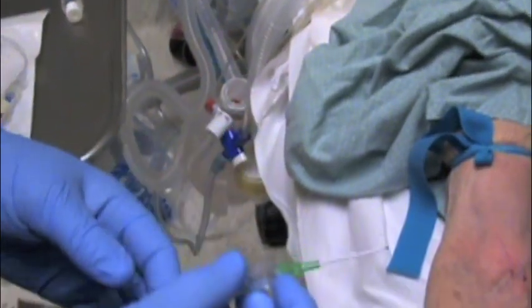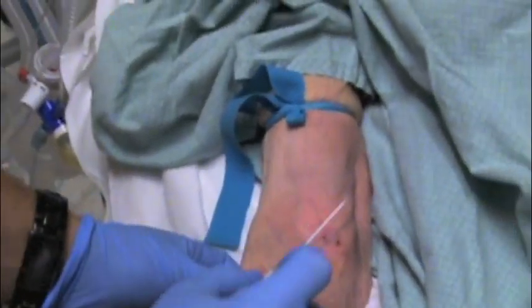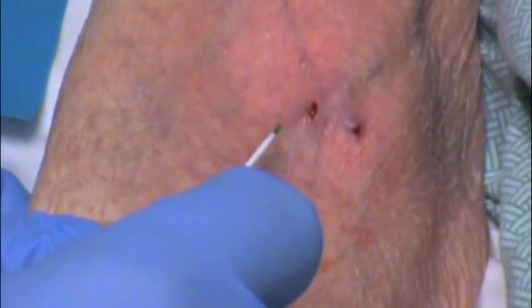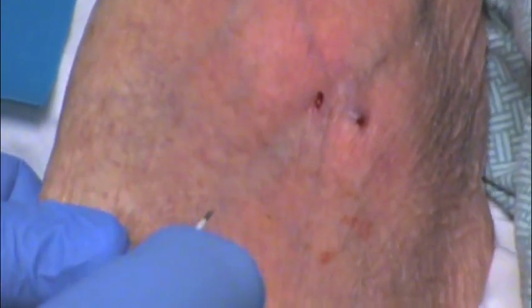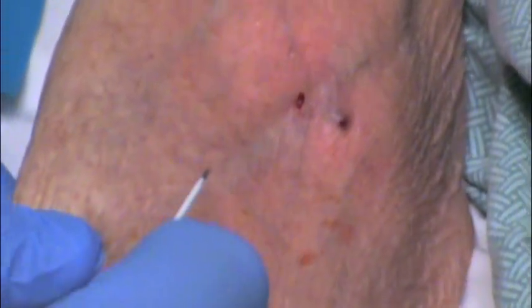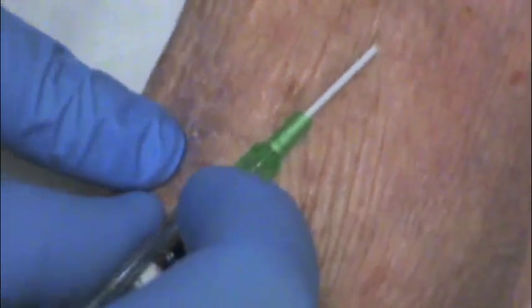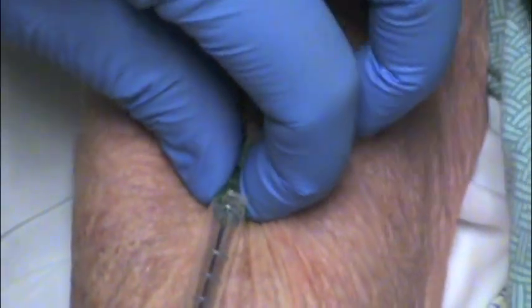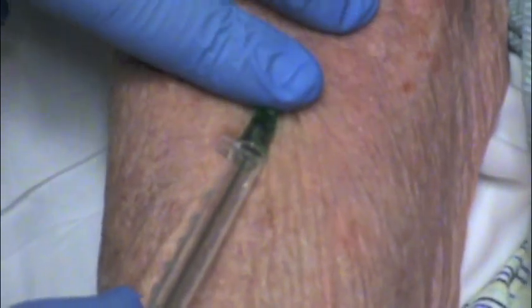Once you've cleaned your site, don't touch it anymore. You want your catheter to end up right in the biggest part of that vein, so start your insertion back here — lay it above the skin, look where the hub is, come down near that, and that's where you're going to start inserting. Go in at a very flat angle. The steeper the angle, the more likely you'll go all the way through the vein. Go in quickly — don't go slowly. You can see the flash right here, so we're in the vessel. Now just advance the catheter with this little lip. Then pull back until it clicks — make sure you hear the click, otherwise the needle is not locked and you could stab yourself with a contaminated needle.